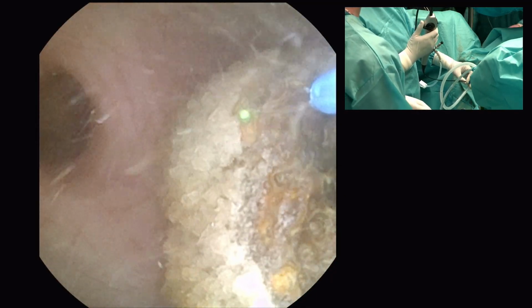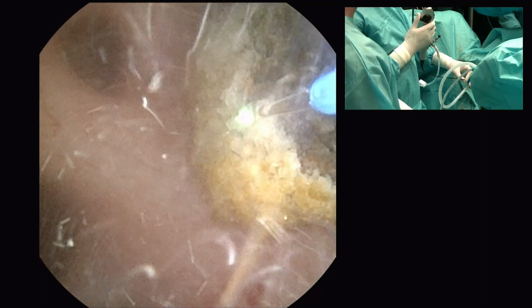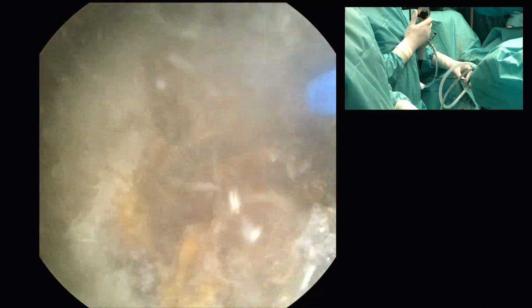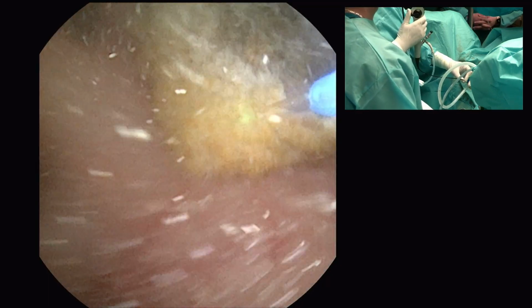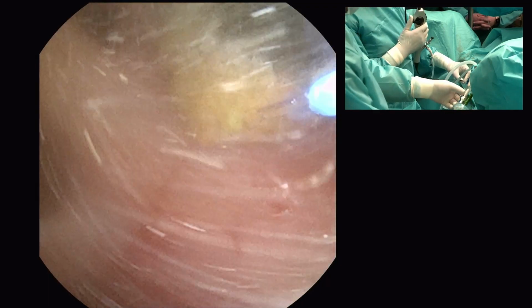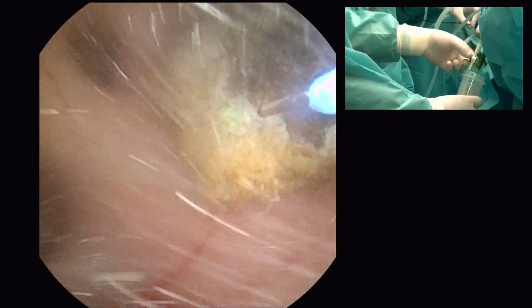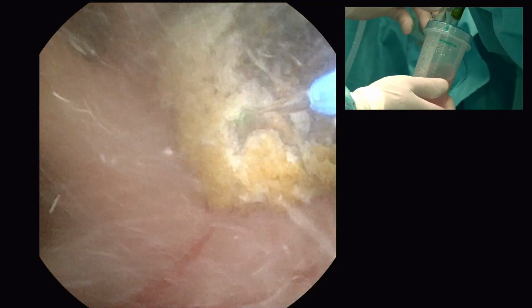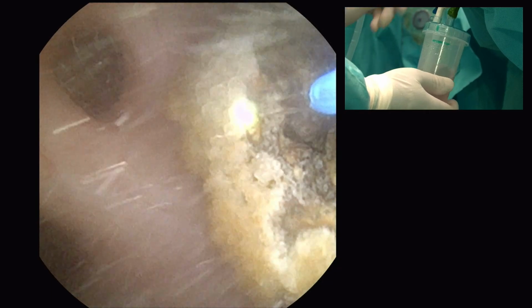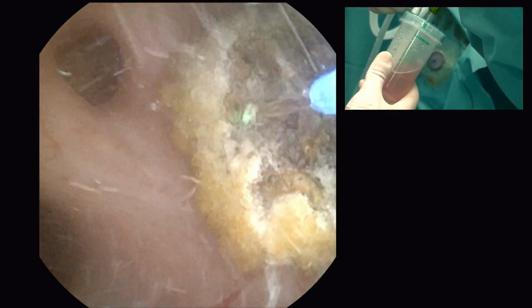Dr. Ruxana is there. Are we audible? Yes. So you can see the fine dusting moving and this dust is being sucked by the sheath. So you have control of the suction also with your assistant.